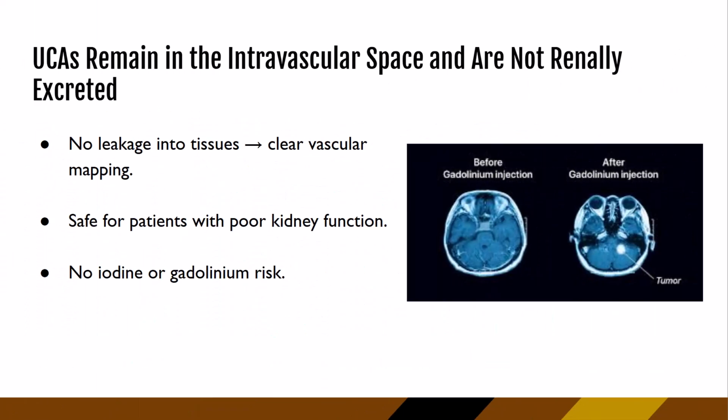So unlike CT or MRI, which can leak into the tissues, microbubbles again stay strictly in the intravascular space. And this is actually a really big strength of the ultrasound contrast agent, or UCA. It's going to allow us to study the vascular architecture and perfusion without paying attention to all that background noise from the tissue enhancement. And even more so, there is no renal excretion involved, making contrast-enhanced ultrasounds a really safe choice for patients with kidney dysfunction.